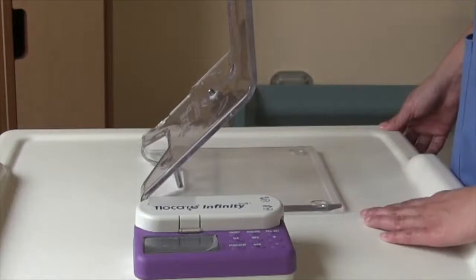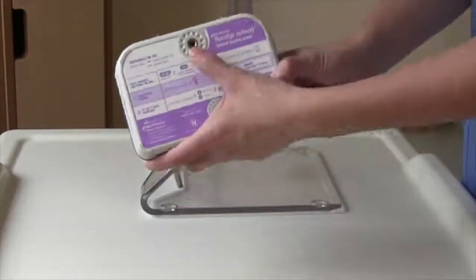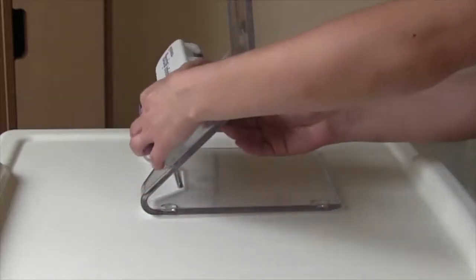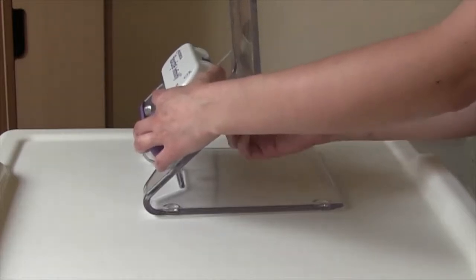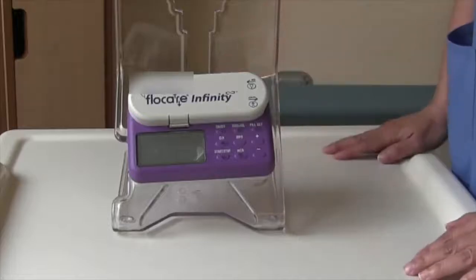So to set up the pump on your stand, simply find the screw connector on the back and place it over top of this screw and simply screw the pump on. Just tight enough so that it doesn't move, and that's how you set up your pump.